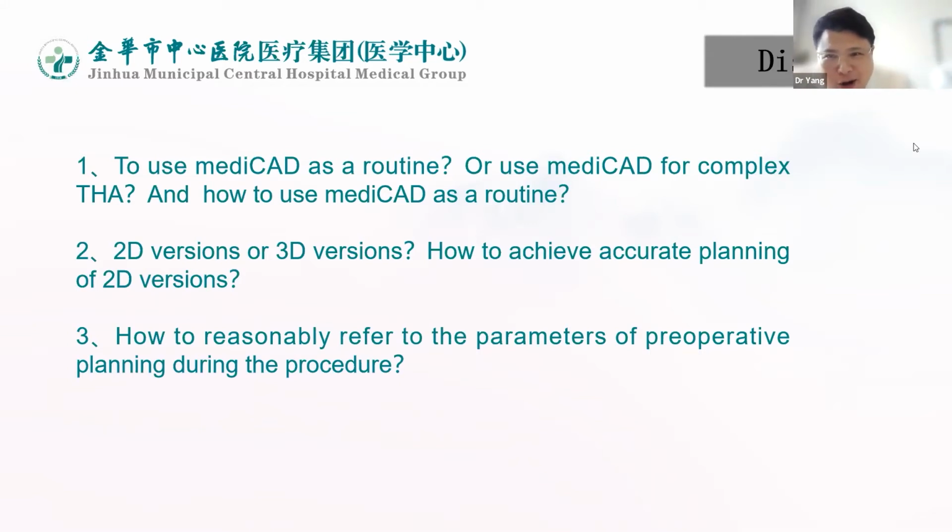The price is lower and lower. So sometimes the company cannot supply all the sizes of the prosthesis. So we must do the templating, and we want to know what size of prosthesis to implant, so we can let the company prepare.